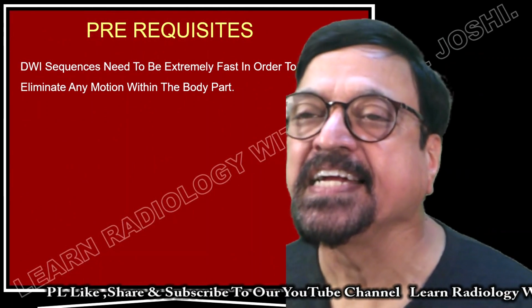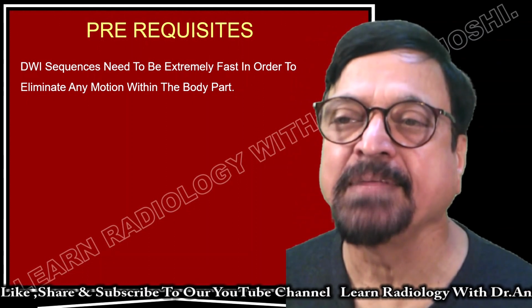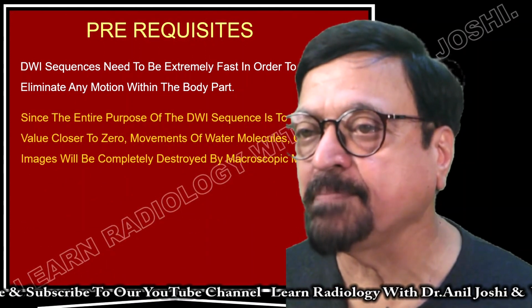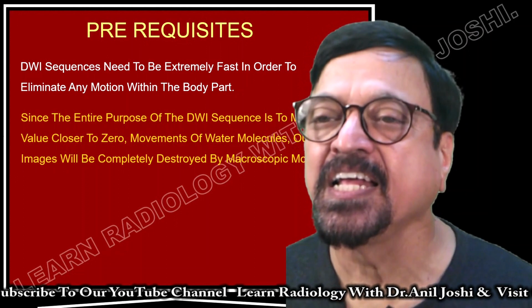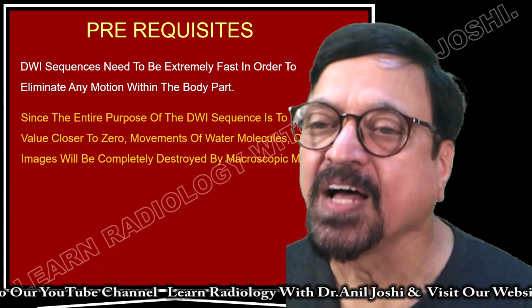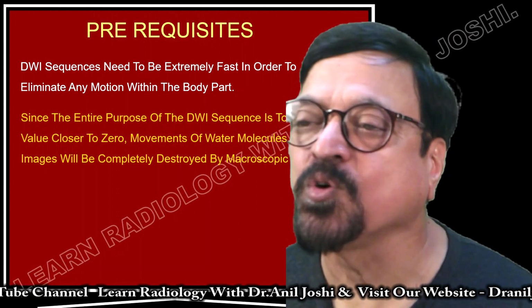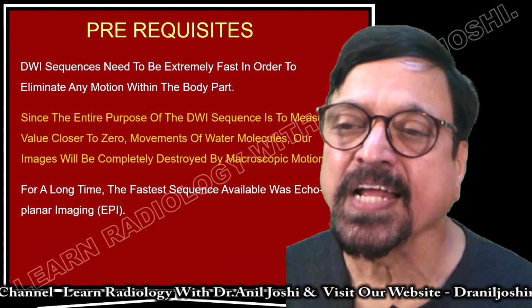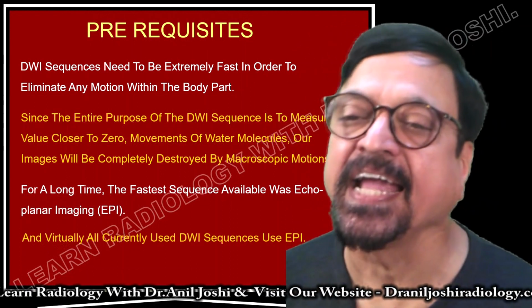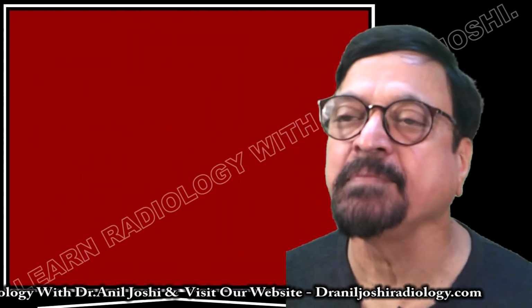Then what are the prerequisites? The DWI sequence needs to be extremely fast in order to eliminate any motion within the body parts. Since the entire purpose of the DWI sequence is to measure values closer to zero, movement of the water molecules, our images will be completely destroyed by macroscopic motions. For a long time, the fastest sequence available was echo-planar imaging (EPI), and virtually all currently used DWI sequences use EPI.